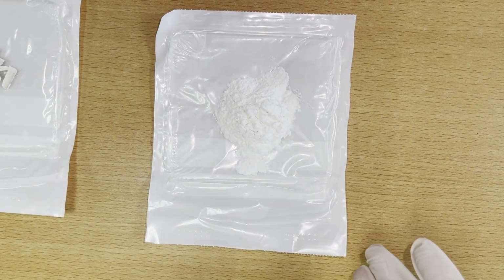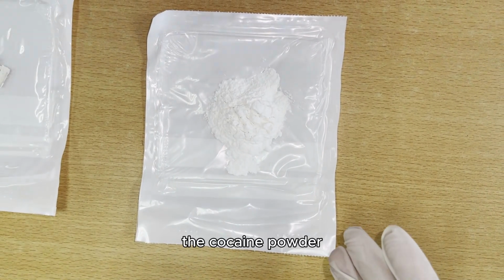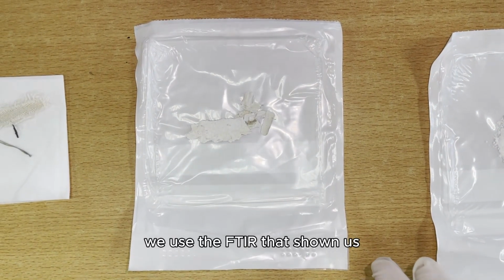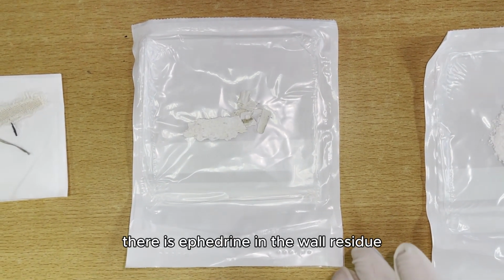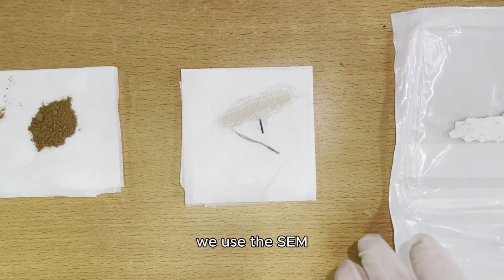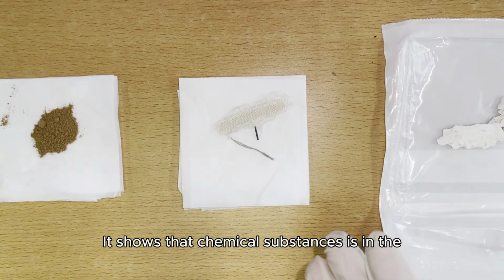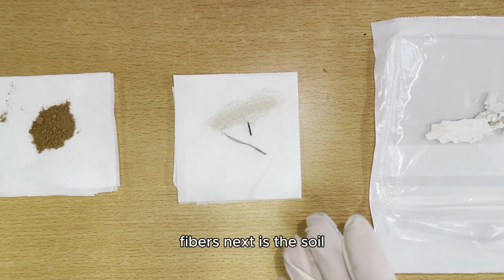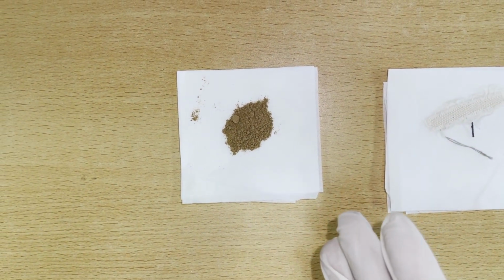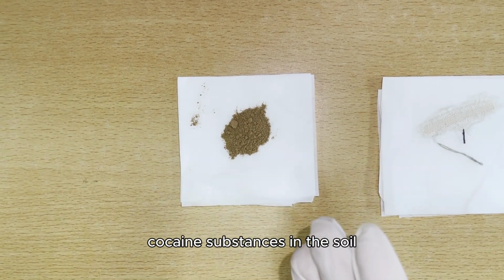So in conclusion, for the white powder we used the GCMS. The results showed cocaine powder. So next is the wall residues. We used the FTIR, which showed us there is ephedrine in the wall residues. Next is the fabric fibers. We used the SEM. It shows that chemical substances are in the fibers. Next is the soil. We used the HPLC. HPLC has shown us that there are cocaine substances in the soil.